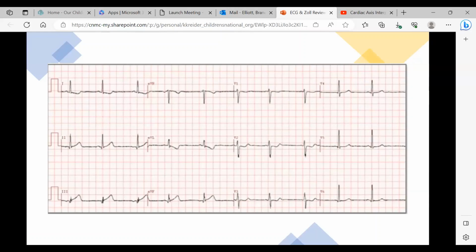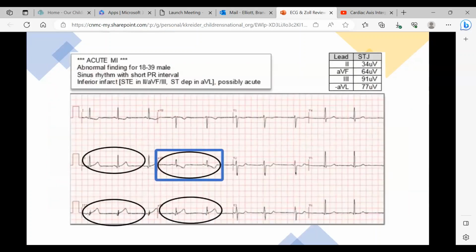So Josh, while Sally's answering, when we go to MedStar, we go to real MedStar. But yeah, Sally's right, it's inferior. Thank you very much. We go to real MedStar for a STEMI instead of the ER. Okay. So because it's inferior, we should do a right-sided ECG again, like you said? Okay. I just have to remember these little tidbits.